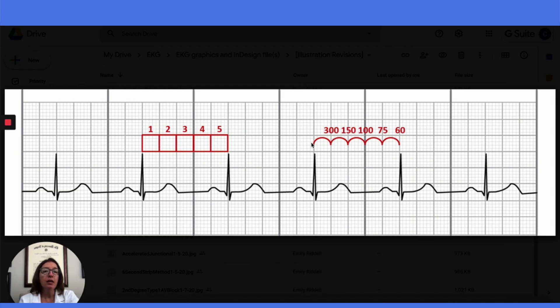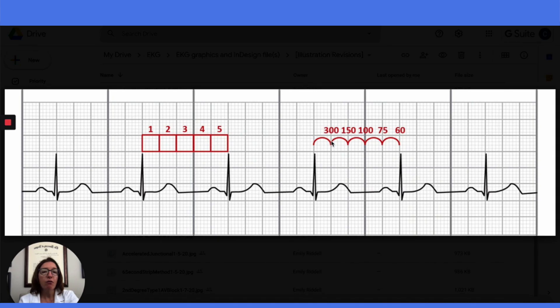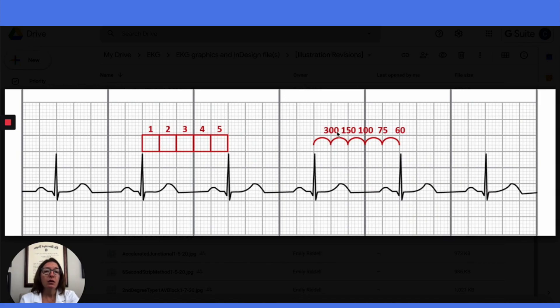Alternatively, with this method you can memorize this number sequence to determine the heart rate. If you go just one box, that's 300; two boxes, 150; three boxes, 100; four boxes, 75; five boxes, 60, and so on. The math behind this is that one box gives you 300 divided by 1, which is 300; two boxes gives you 300 divided by 2. It's basically the same calculation, just memorized as a quick reference. This is the big block method — definitely an option, but in my opinion the small box method is better.